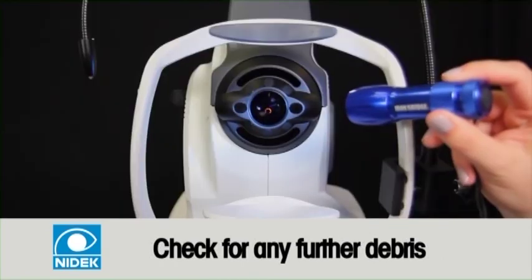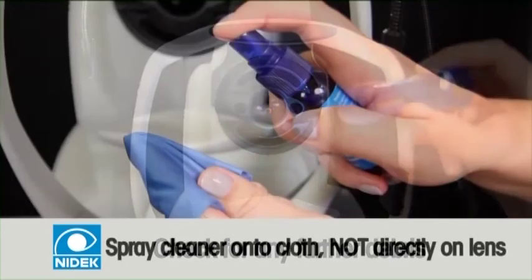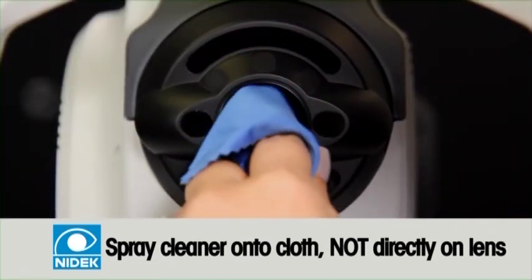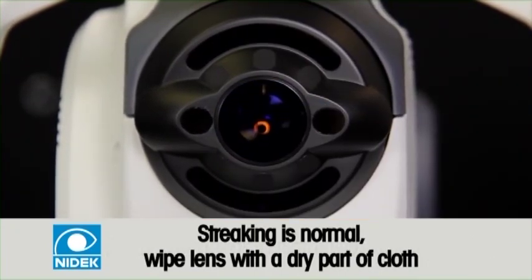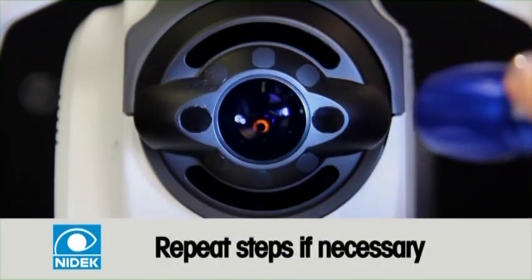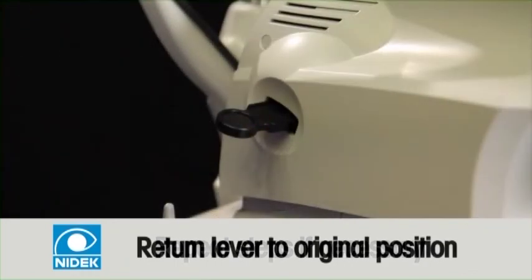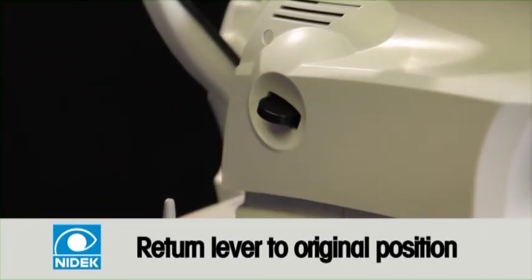Once done, shine the light on the objective lens again to see if you removed all the debris. If debris still remains, spray the lens cleaner onto the microfiber cloth and rub lens in a circular motion. It is common to have streaking on the lens after using cleaner. Use a dry area of the cloth to remove streaks. It may be necessary to repeat these steps several times to clean oily and hard to remove debris. When done, press the objective lens cleaning lever on the side of the AFC to its original position.